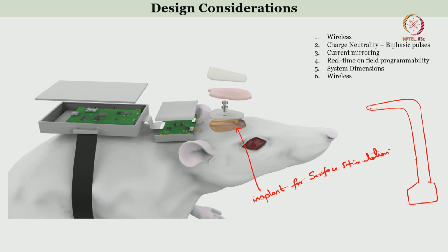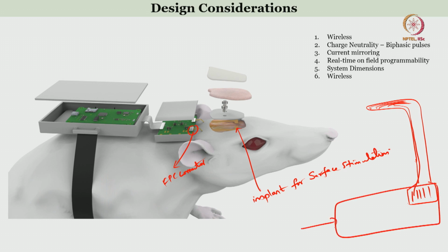And there will be 5 electrodes in this or 6 electrodes, whatever it is, typically you can take whatever the number is. So, typically we have multiple electrodes, and there is a contact pad corresponding to all the electrodes. Here we use something called an FPC connector. There is an FPC connector which houses this implant.